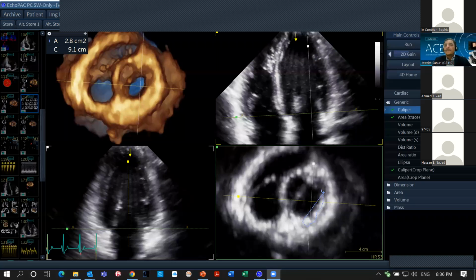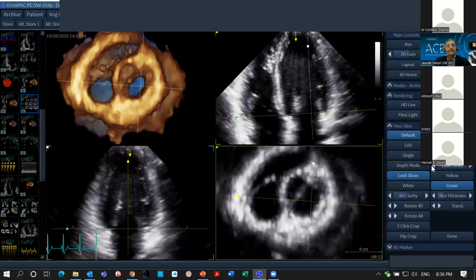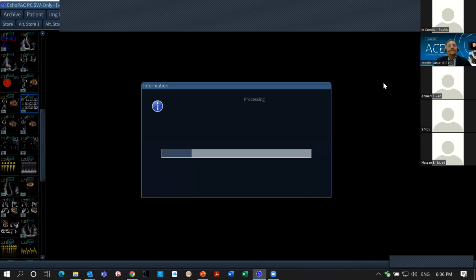So for example, here you'll get a number like 7 or 6.5. But with another method, the MVQ automated method, you will get a much higher number. Yes, let's just do the MVQ here. So measure valve for the auto MVQ.